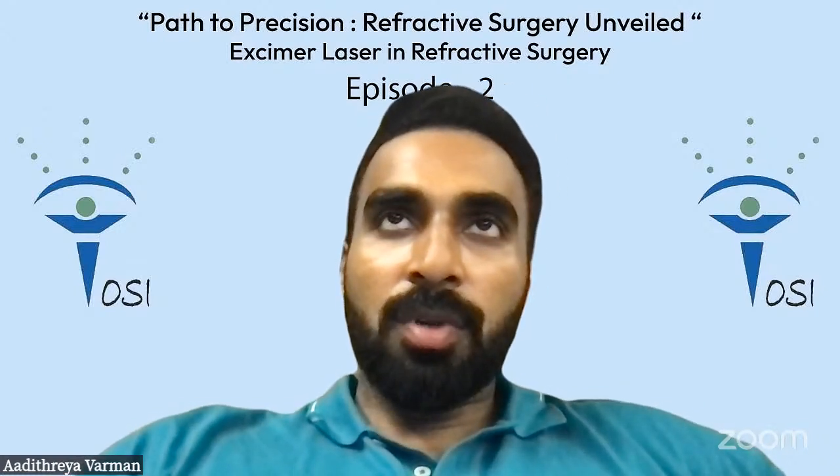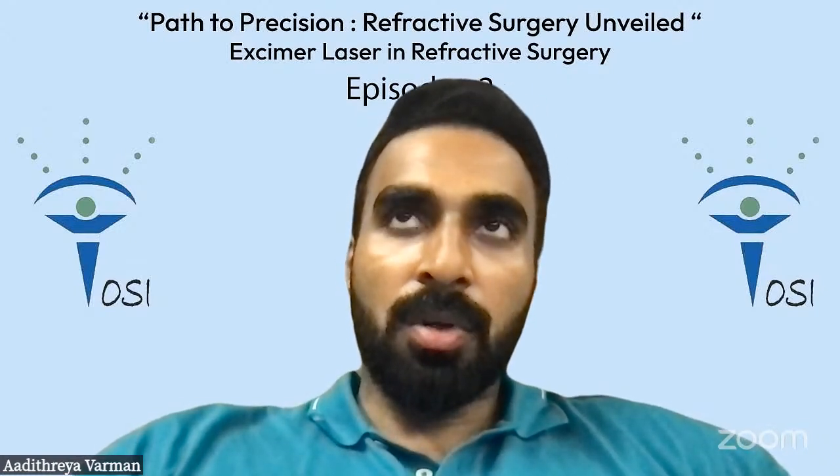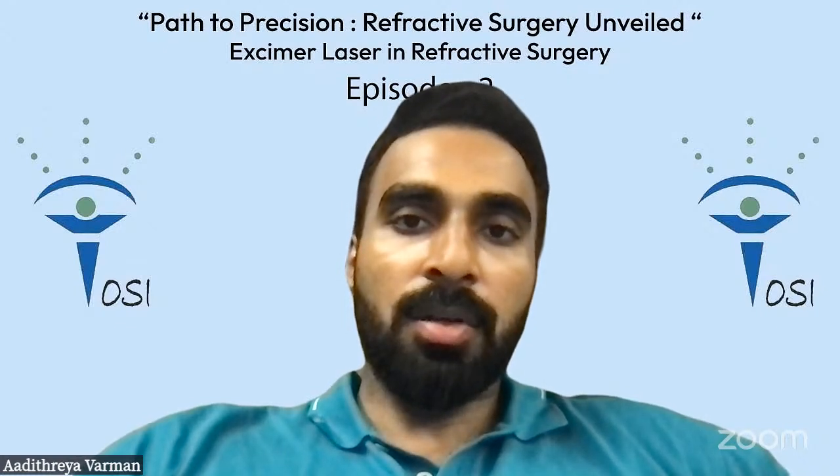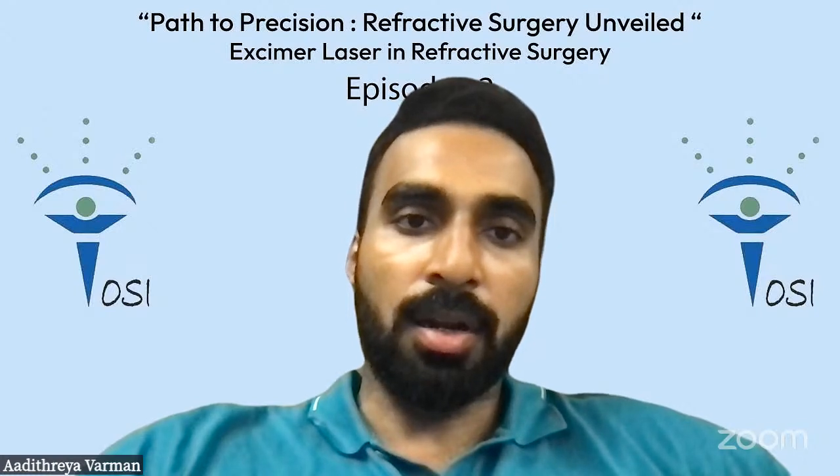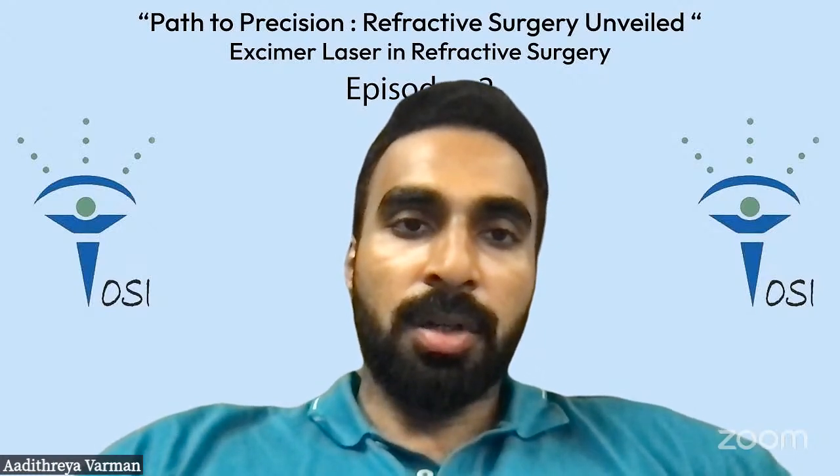If you've done hyperopic laser and you've induced negative aberration, and if the negative aberration is lesser than what you need when the patient has got cataract, put in a negative spherical aberration IOL.